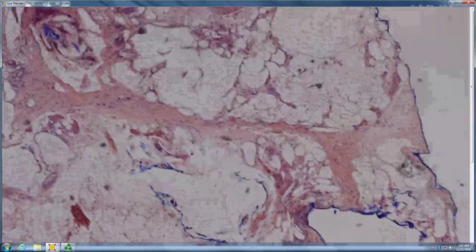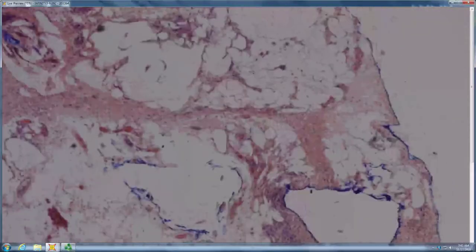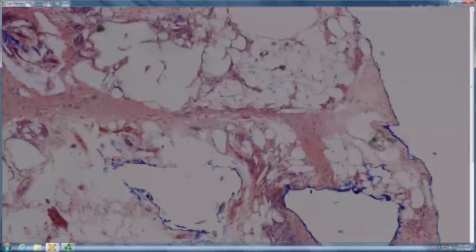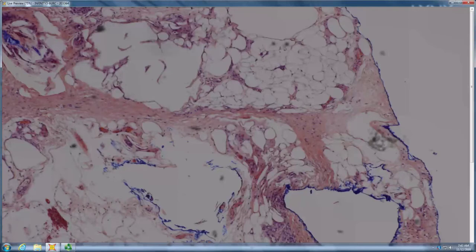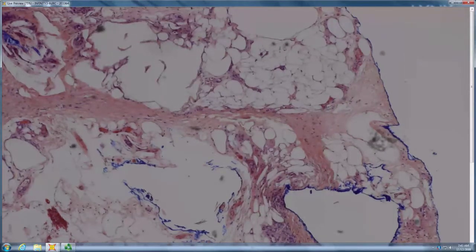And then tell me about the fat with those areas. It's lobular. I would look for lipomembranous change, and it's not really prominent. There's a little bit of frost on a windowpane right here. But even without prominent lipomembranous change, given the overlying stasis and the fat necrosis, this is likely lipodermatosclerosis.